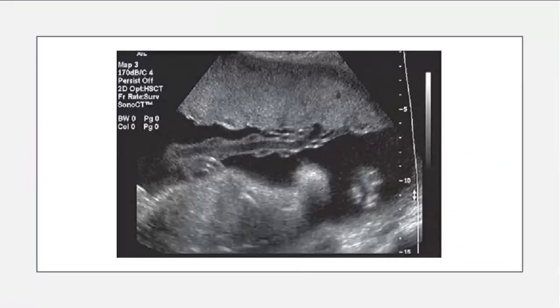So here's a standard picture of what our placenta should look like. Now, in terms of location, that's going to be different for each patient. This patient is an example of an anterior placenta, because if we remember, here's our anterior anatomy, posterior anatomy, and here we see this nice, smooth, medium level echogenicity placenta. Here are our smooth lobulations of that chorionic plate, the fetal aspect. Here's our umbilical cord communicating with the placenta into the baby, and then some more smooth lobulations.